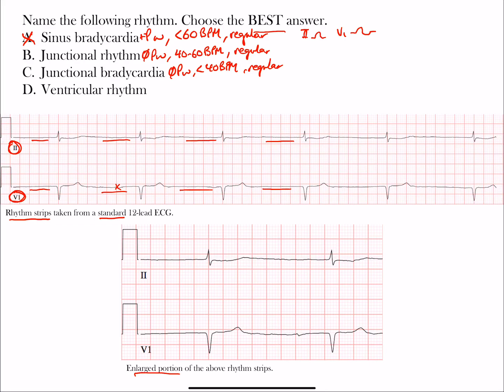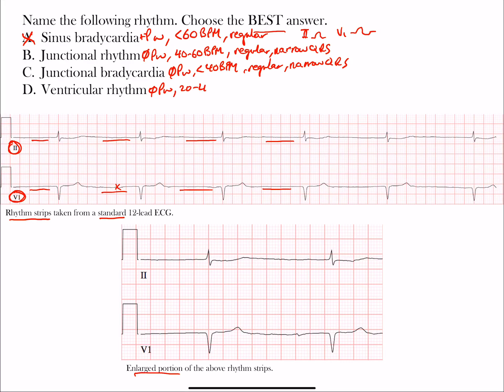Both junctional rhythm and junctional bradycardia tend to have narrow QRS complexes. Now let's talk about ventricular rhythm — also no P waves, though with retrograde conduction you can see P waves, but we don't see that here. A ventricular rhythm has a rate between 20 and 40 beats per minute, is typically a regular rhythm, and has wide QRS complexes — that's what differentiates it from the junctional rhythms above.